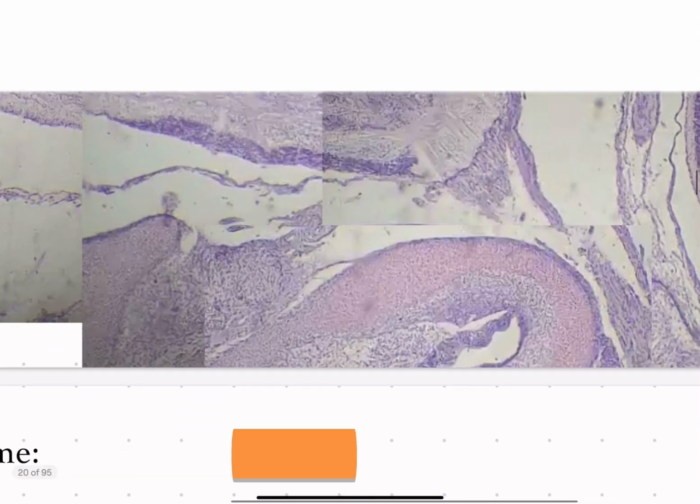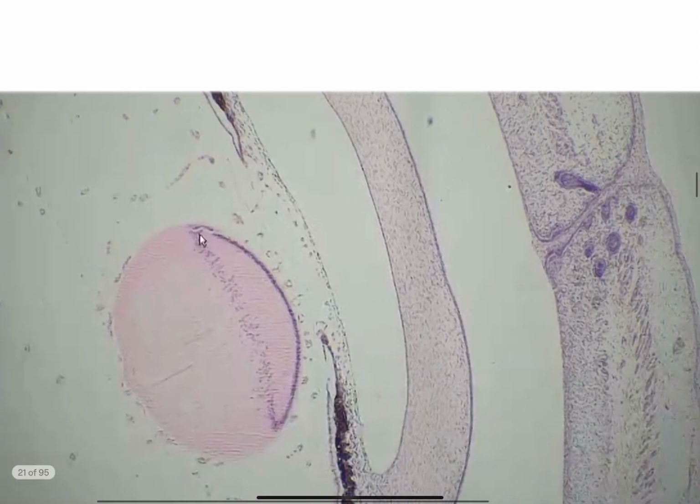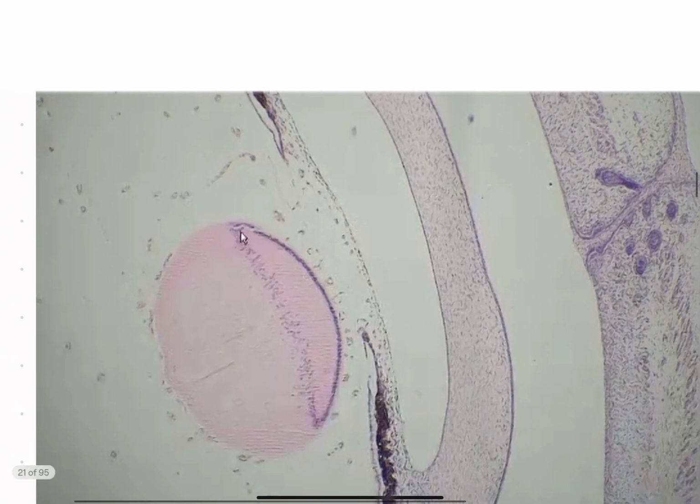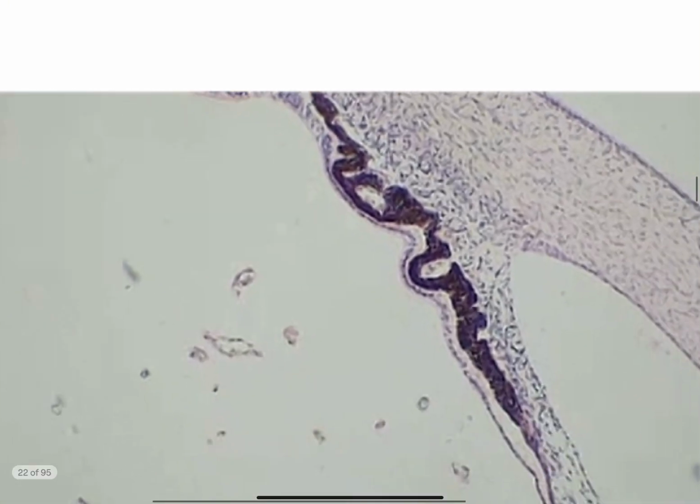Okay. Next up is one that we should be familiar with by now. So please write down the slide name. Now we're going towards the top part of this slide, and we see something like this.